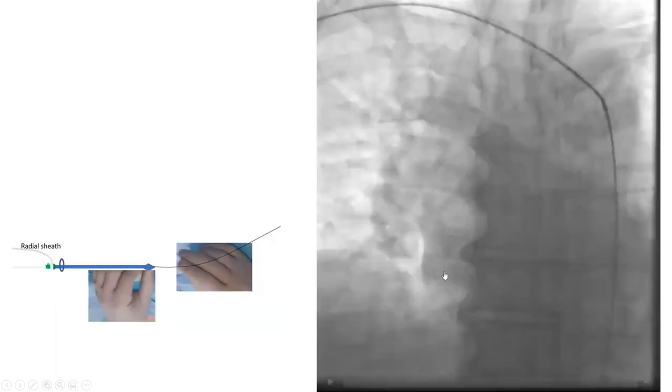Here's the best way of doing it. You need to advance the wire deep in the descending aorta and advance the catheter over it into the descending aorta. Then I pull the wire, and from the descending aorta, I pull the catheter with a certain torque maneuver. It is always consistently from a right radial a counter-clock maneuver. So you pull the catheter from descending with a counter-clock maneuver and it will fall into the ascending aorta.